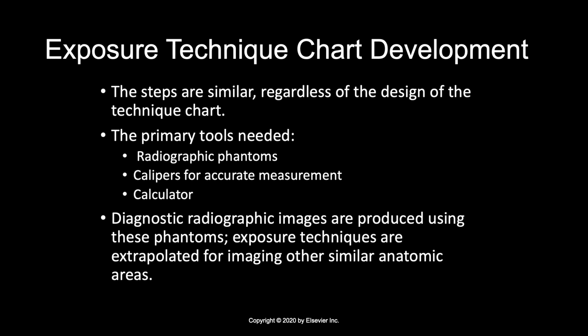But now we have to radiograph a shoulder. So the radiographer is going to measure the shoulder in the AP and determine that it also measures 10 centimeters. So now the radiographer does not have a technique chart for a shoulder. So the concept of comparative anatomy states that the shoulder in this case can be radiographed using the same technique that we used for the knee, because it is the same measurement, 10 centimeters.